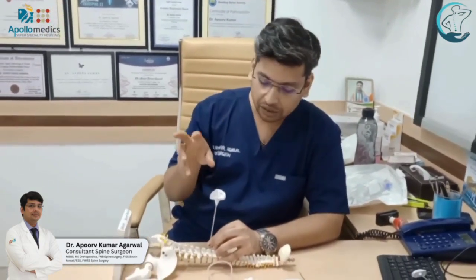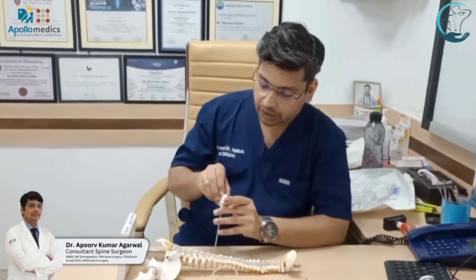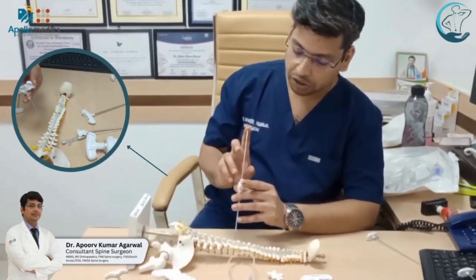After confirming our position, we go inside the vertebral body with the help of a Jamshidi needle. Once we are in the body, we remove the inner stylet and use a guide wire to maintain our position.